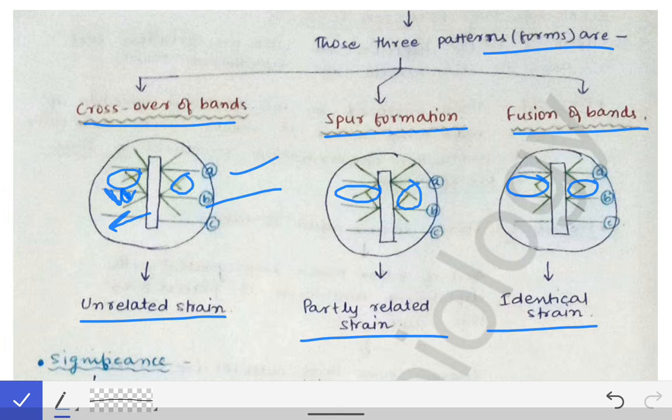Now, precipitation test, in vitro precipitation test. So why is this called precipitation? Because we know that whenever the antitoxin meets with the toxin, a precipitation line forms. So that's why it is the precipitation test, and that is the definition of the Elek precipitation test. So I have explained the definition of the Elek precipitation test also here.